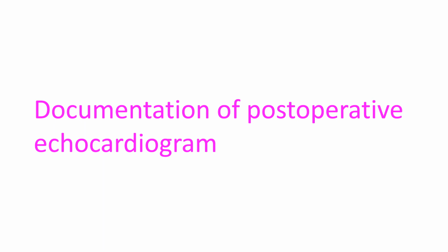Details regarding post-operative echocardiogram, if available, will be quite useful for comparison. It has been suggested that periodic documentation of reports are needed for future comparison. First evaluation should be within 2 to 4 weeks of aortic valve replacement. A repeat transthoracic echocardiogram is needed when there is clinical symptoms or signs suggesting prosthetic valve dysfunction. Transesophageal echocardiography may also be needed in selected cases. Most often, transthoracic echocardiograms are enough for the evaluation of prosthetic aortic valve.